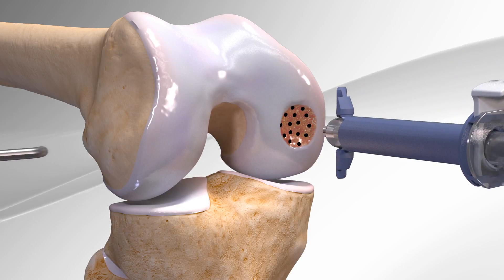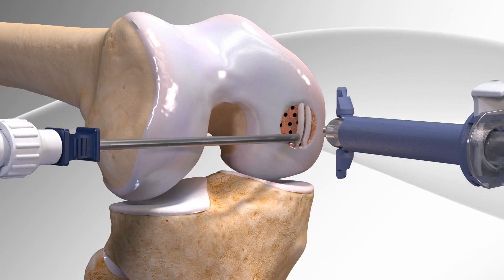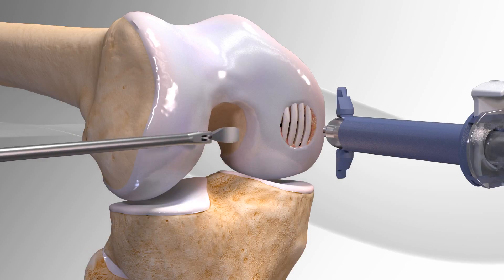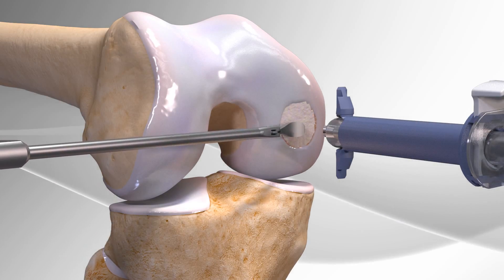After it is dry, the surgeon uses a delivery needle to place the biocartilage onto the surface. A curved instrument is then used to smooth out the biocartilage to the cartilage around it.